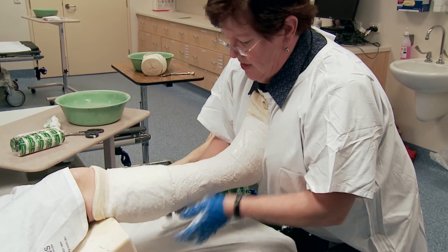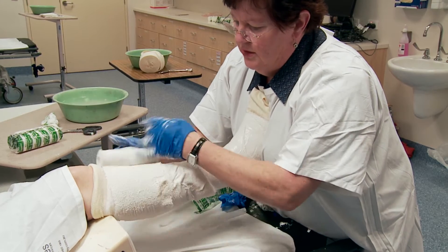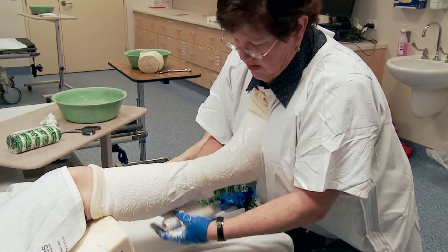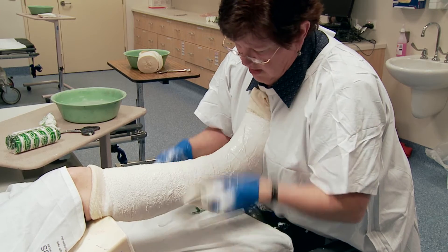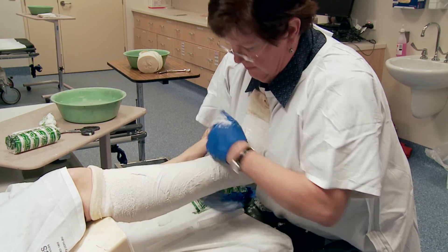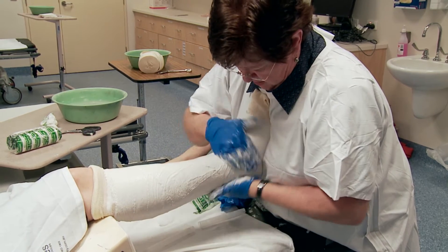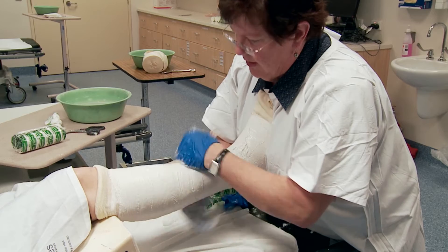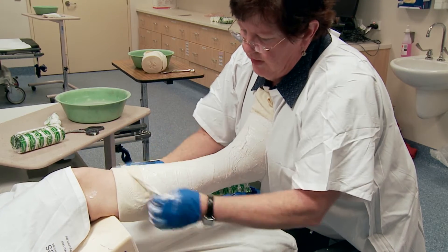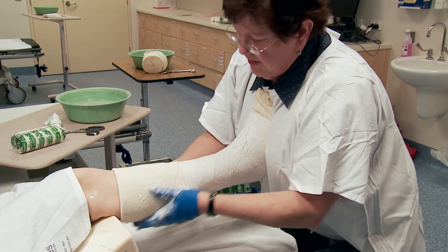Then you do the join. Never ever pull it — just up and drop. Caress it, which moulds it towards the skin, gives you a firmer contact and less air between the plaster and your skin. Hold that down — the saw won't like that bit of excess, but that's okay.